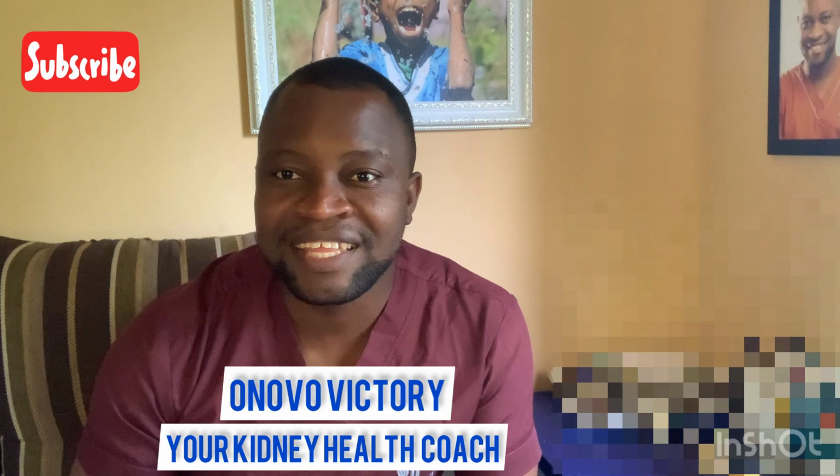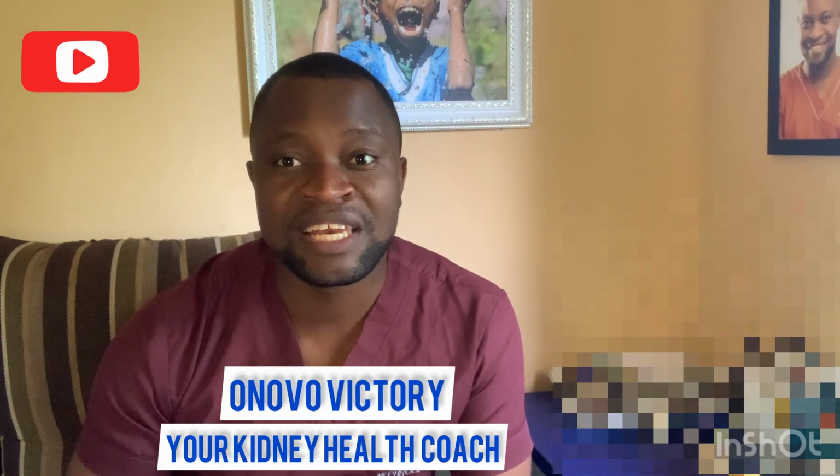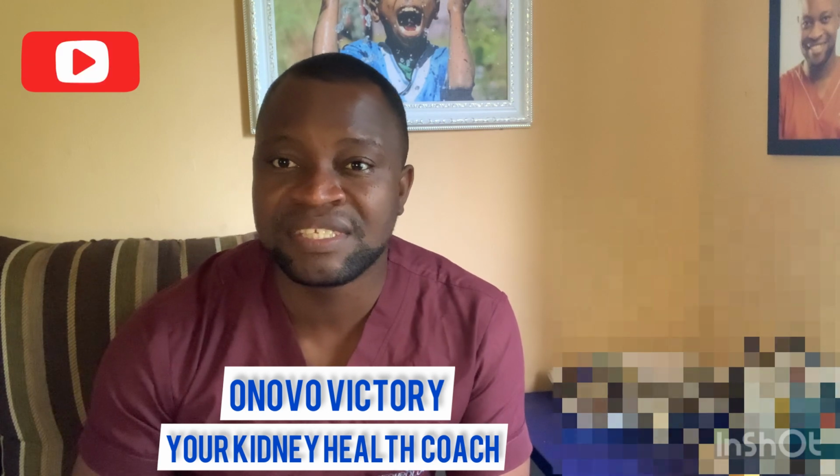Having said that, we'll move over to the 3rd point. The 3rd point is that if you're checking your blood sugar level at home, and you're about to check it, you need to assemble everything together.